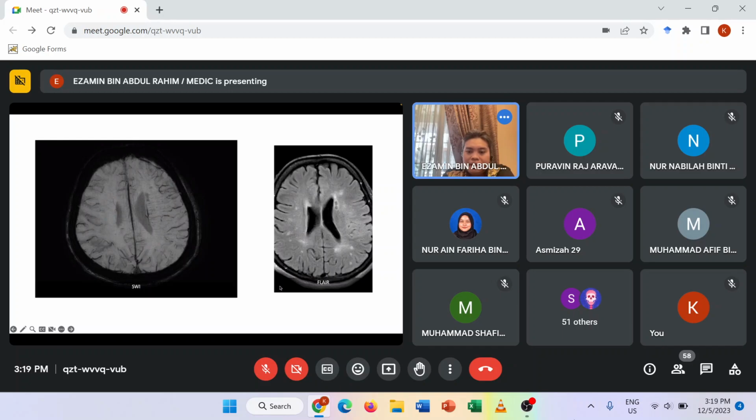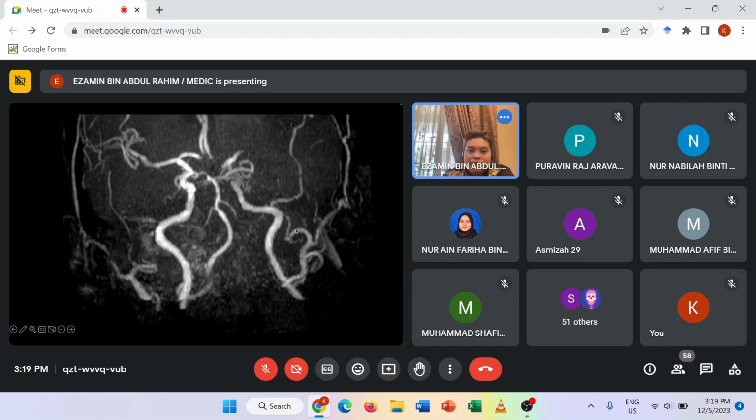Once you do the MRI, you don't see the M1, the MCA. This one, maybe you don't see its A1, not sure why. Sometimes they can derive from the other side, alright? Or sometimes it can be hypoplastic as well.